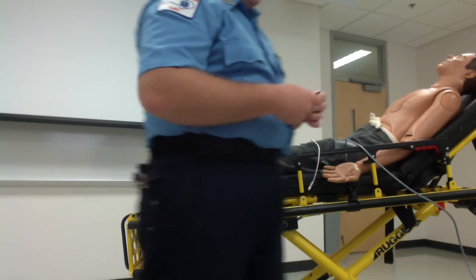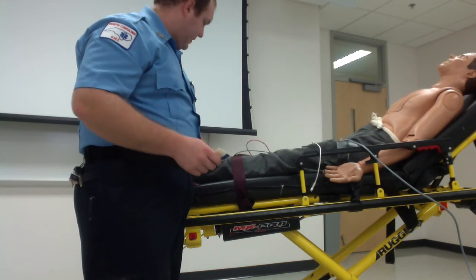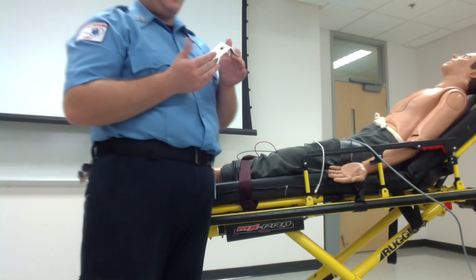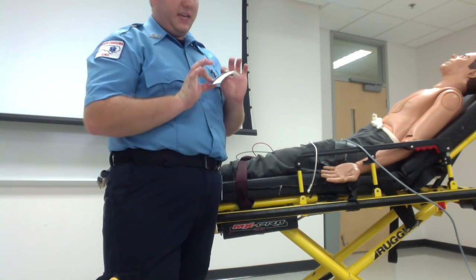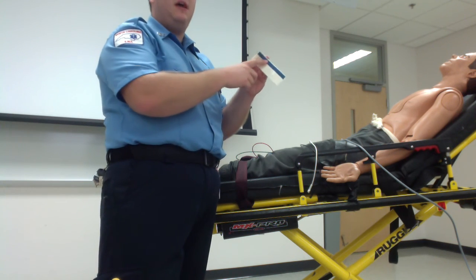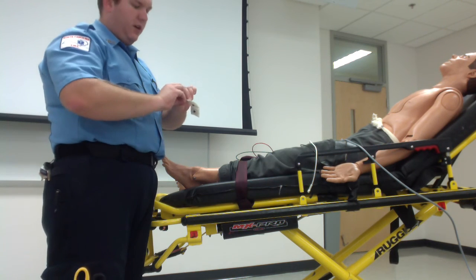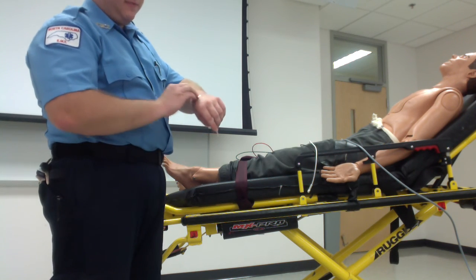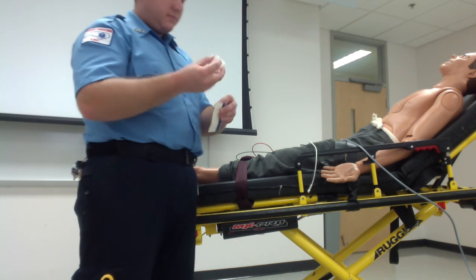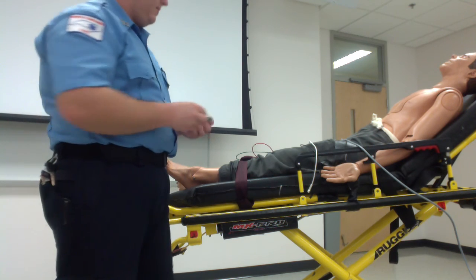I'm not actually going to stick wires to this mannequin, just because it'll get them all gooey. Not like he's not already. But one thing I like about the 3M leads is the way they come packaged. They have basically a piece of sandpaper on the back of the paper, so you can use that to sand down the skin and prep it before you put the lead on. That way it's likely to stick a little bit better.